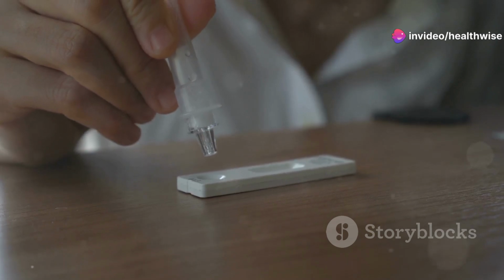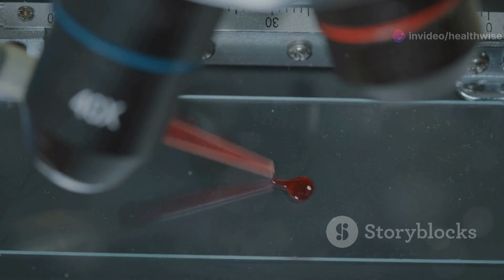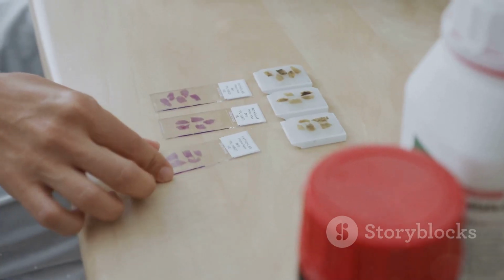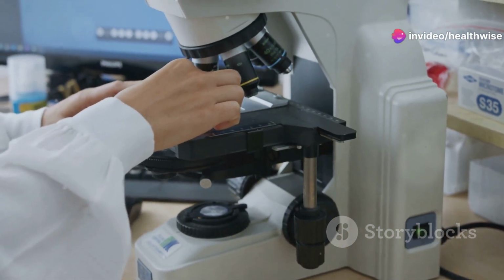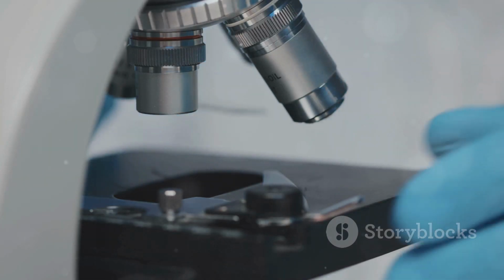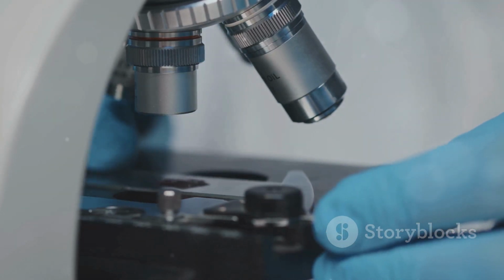Next, place a drop of normal saline and a drop of Lugol's iodine on a glass slide. These solutions help in differentiating various components under the microscope. Mix a thin suspension of the feces into each drop. This step is crucial for spreading the sample evenly, which aids in a clearer microscopic view. Cover these drops with a cover glass. This not only protects the sample but also ensures a flat surface for examination.